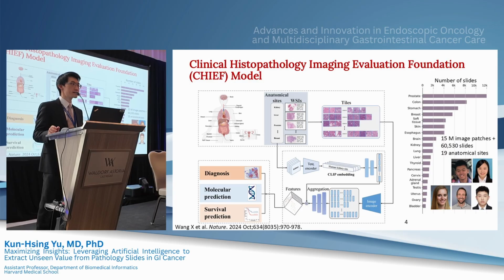And here we leverage a similar concept as published in the CLIP model. It is a model released by OpenAI, it's publicly available and open sourced. And the concept of this CLIP model is to align the text embeddings with the image embeddings to maximize the information that we can extract using this joint extraction method to increase the efficiency. And once we extracted these image features, we aggregate the tile level image feature into a sample level, the whole slide level representation. And when we have these whole slide features, we can pipeline into multiple different diagnostic models.